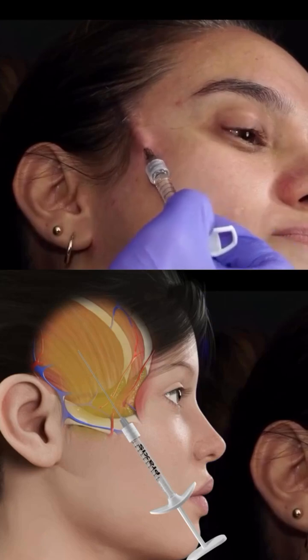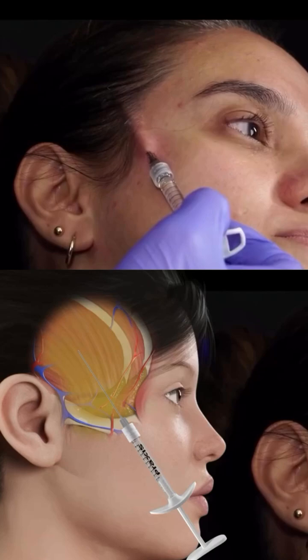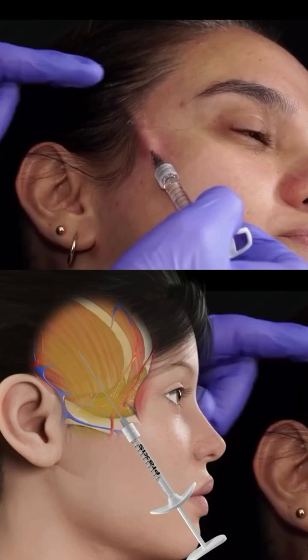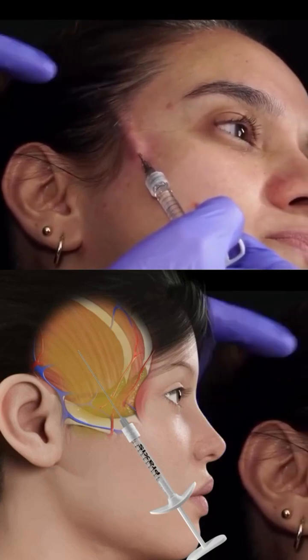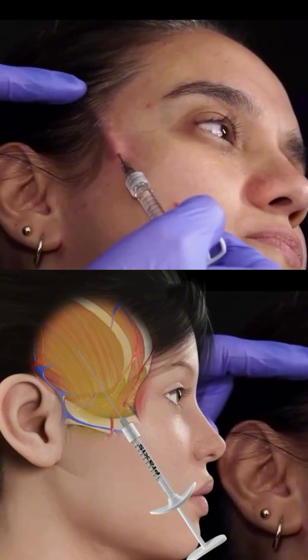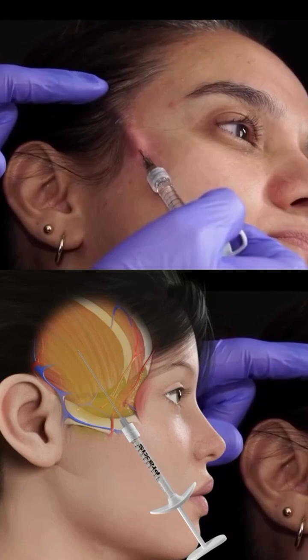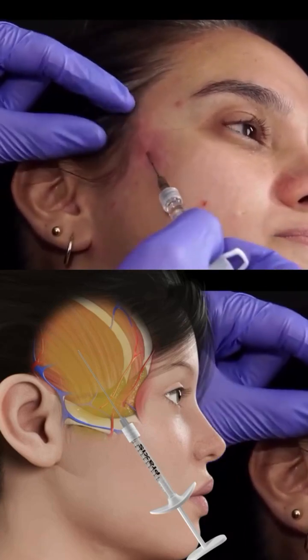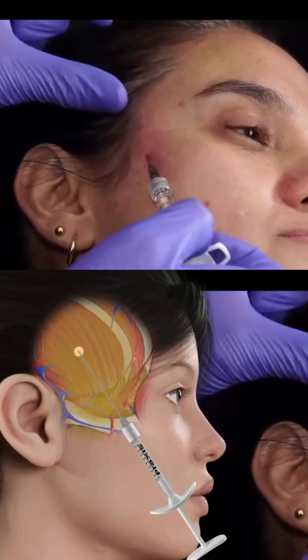I inject lifting my cannula upwards. This way I ensure I am above the parietal branch of the superficial temporal artery. At this level, I can calmly inject one cubic centimeter of my product.